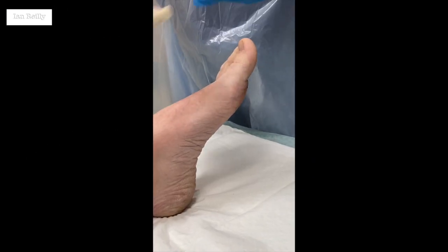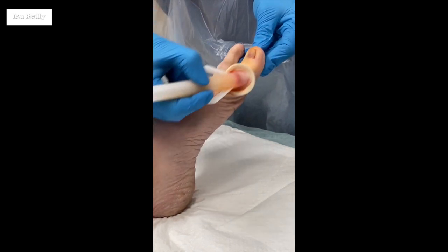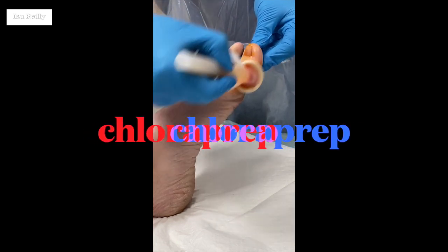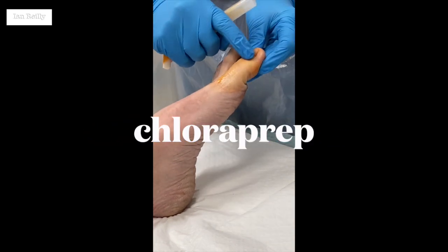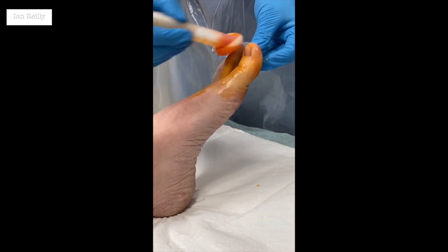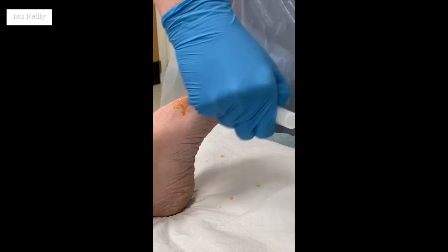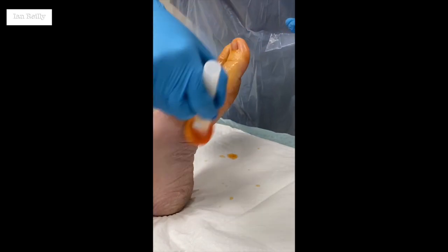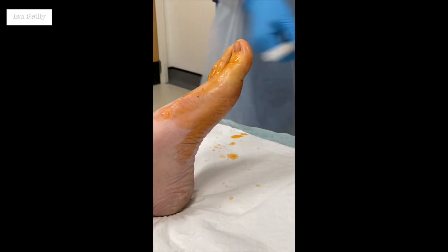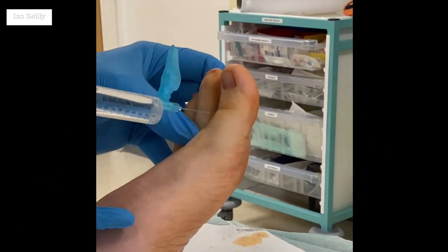So we're going to use — it's kind of similar to Sablon really — get you nice and clean before we start. I think I took a picture of that the other week when you came through. So if we get a nice little video of this we'll see if we can make you an internet sensation. So these are these safety needles — we absolutely love them. Andrew, a little scratch coming up, okay.